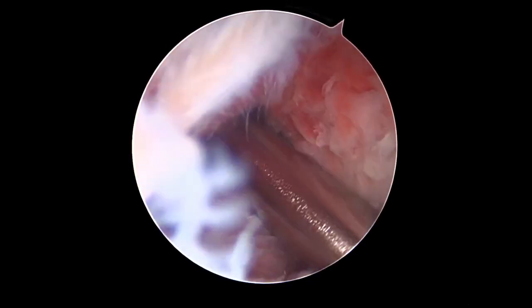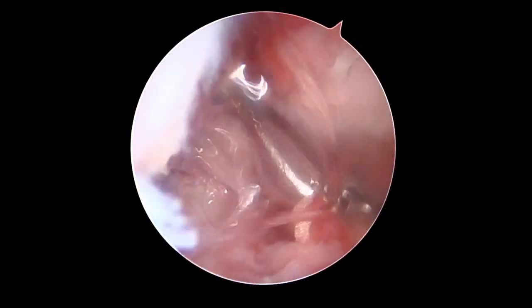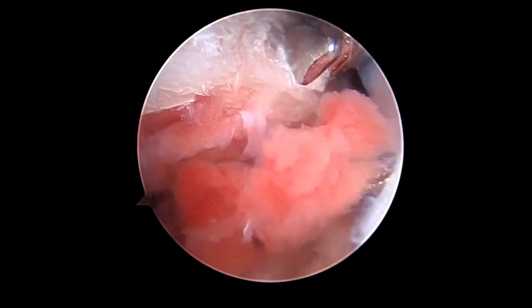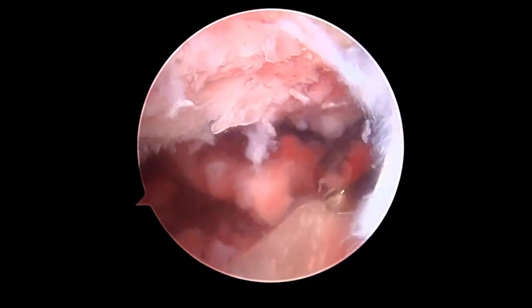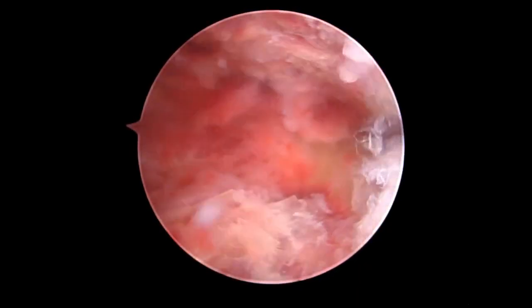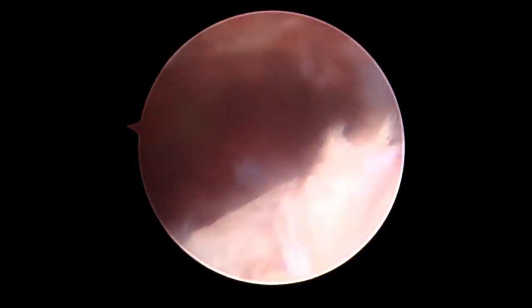After the fracture gap is entered, excessive fracture hematoma is cleared with the arthroscopic shaver along the fracture zone to help expose the fracture end for subsequent reduction. Using the distal anterior portal as the viewing portal, further debridement of the fracture end can be performed with a hemostat or arthroscopic shaver. Excessive periosteum dissection should be avoided to preserve blood supply.